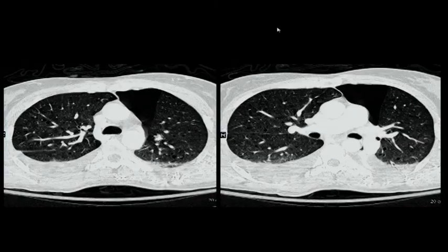This is the last question. Who will it go to? Ati? These are axial images of the chest at the level of the pulmonary arteries, and this is at the level above the arch. So I see this. Ati, you can redeem your cup of coffee here also. But the diagnosis has to come out.